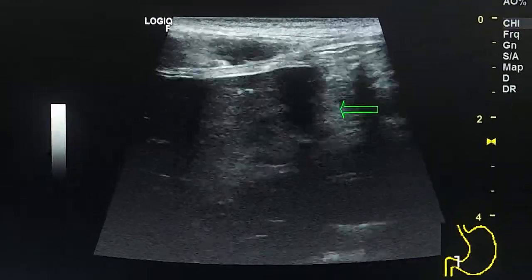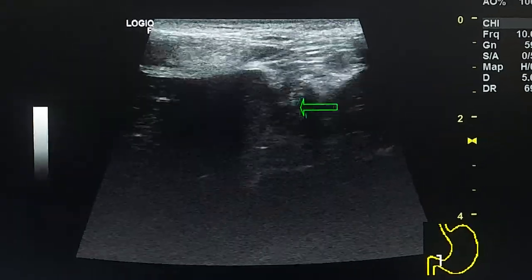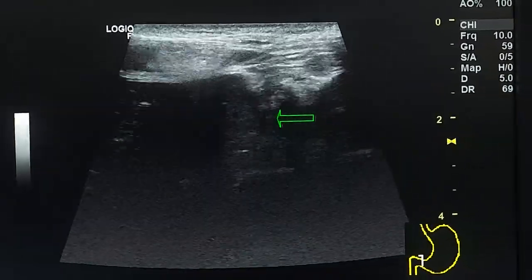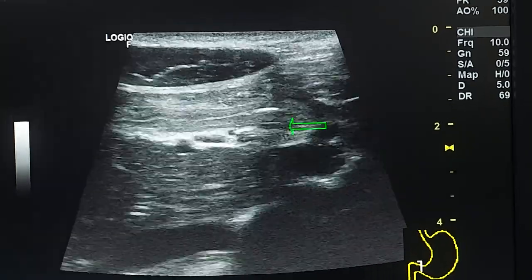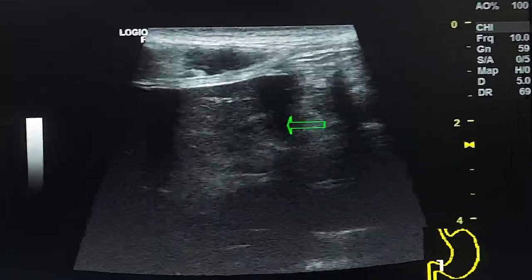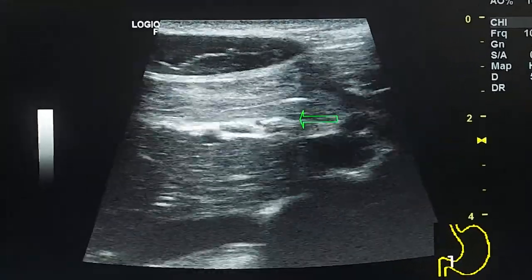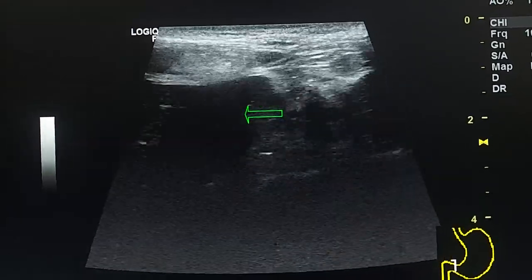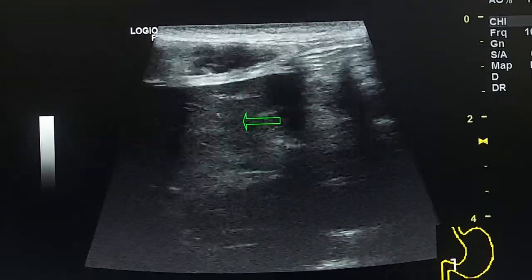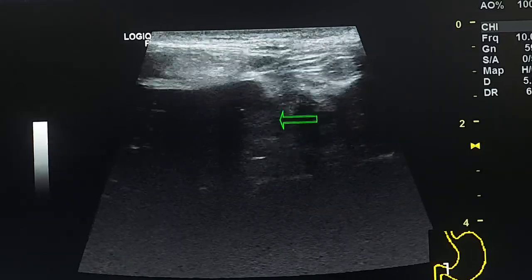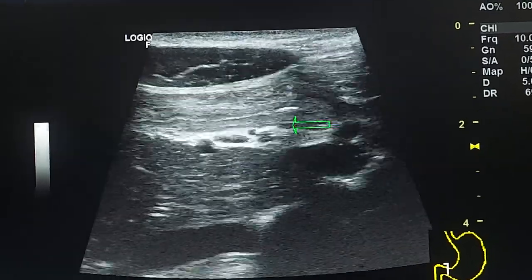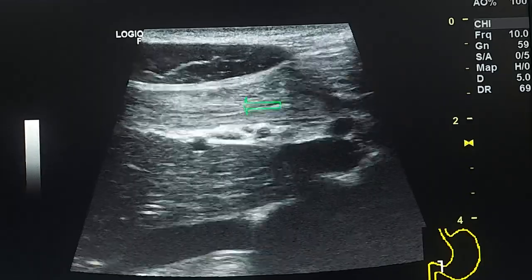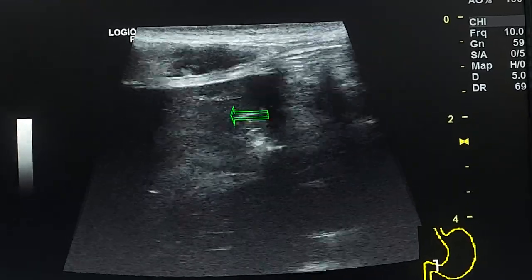Here we see echogenic foci but they are inside the lumen, and we see comet tail artifact behind them. We don't see absence of the layers of the wall, so these are inside the lumen — but this defect is inside the wall.